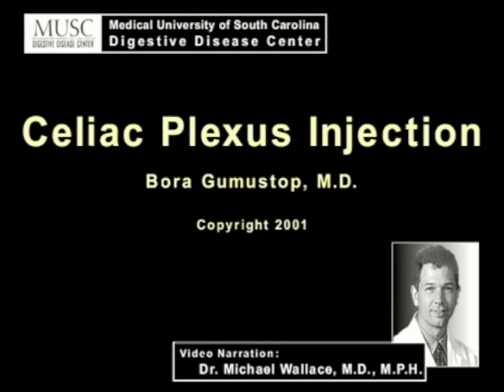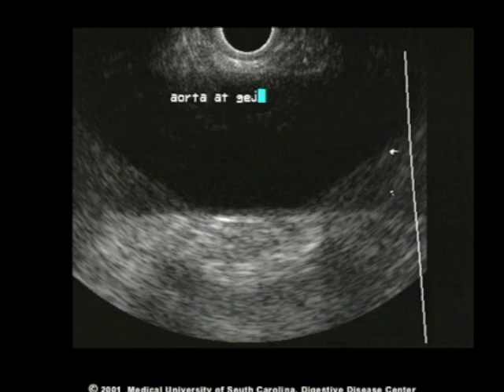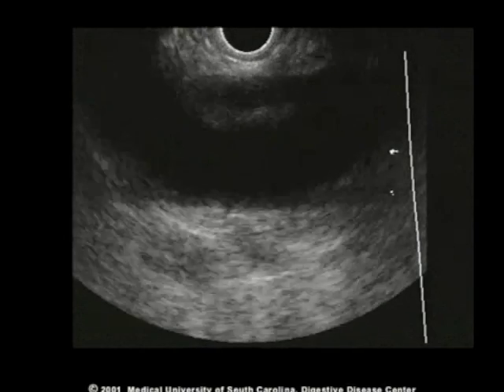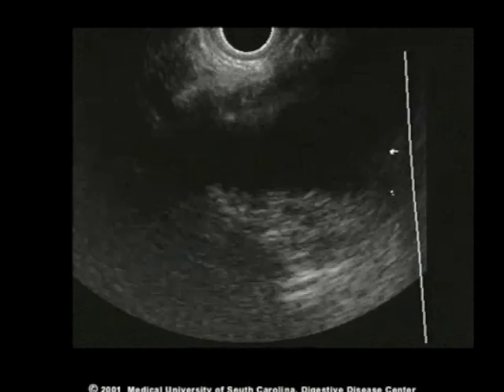Celiac plexus injection is an effective technique for controlling pain in chronic pancreatitis or pancreatic cancer. To identify the celiac plexus, the descending aorta is identified at approximately 35 centimeters from the incisors.